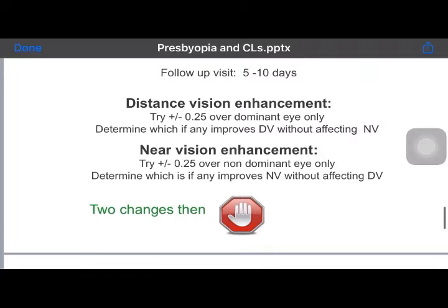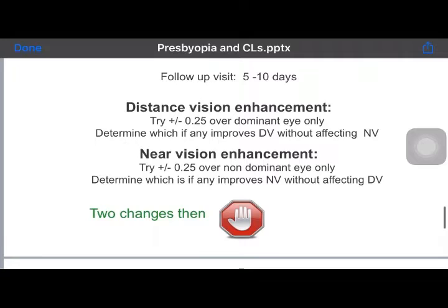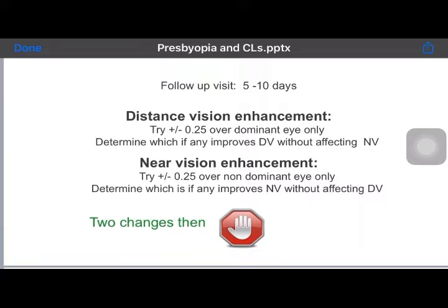And let us say, after troubleshooting, if the patient becomes happy and satisfied, you can always give them a call after 5 days and have a look at how their vision is, because it might become even better than what you have given them today, because the brain learns to accept that simultaneous vision perception that we discussed in the beginning.